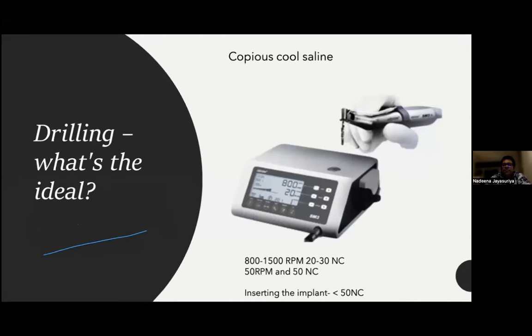So it's important to have a good machine which is reliable. So it's going to be a bit costly when you invest in this, but it's a must if you want to do dental implants. But there are certain companies that will rent out these machines. So that's also a good option.